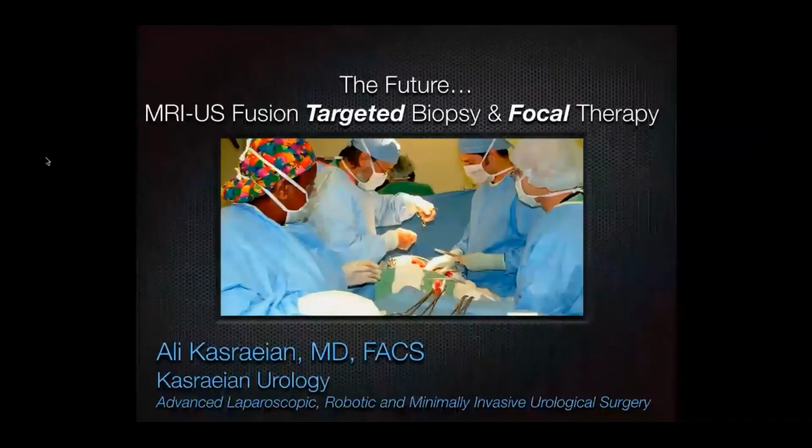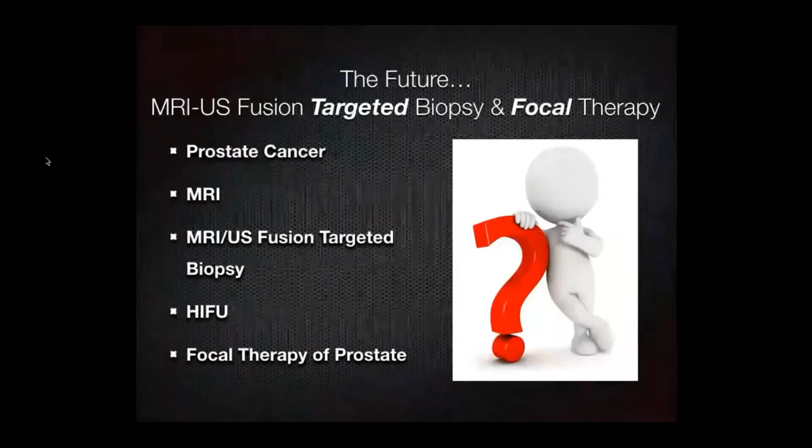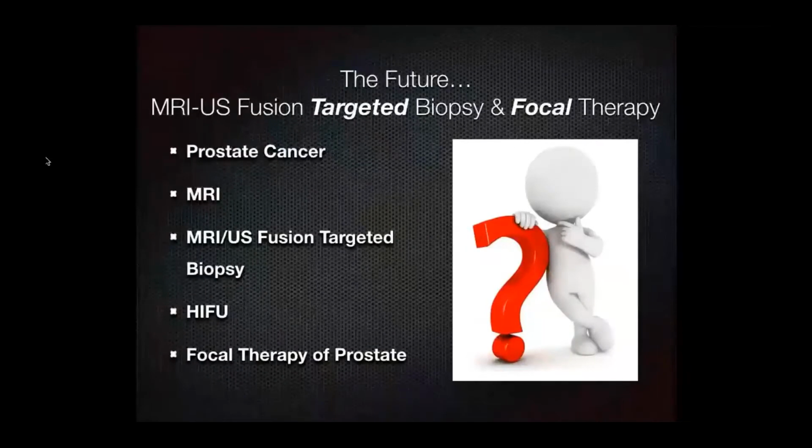But the thing I want to talk about today is a brief overview of prostate cancer and the screening controversy, and why the technologies I'm going to discuss today matter. I'm going to talk about multiparametric MRI, an imaging modality that tries to look within the prostate, identify tumors, and grade them with a system called the PI-RADS score, which tries to mimic the BI-RADS score for breast cancer, so that we can find tumors that matter, and then use MRI ultrasound fusion targeted biopsy to actually target those areas.